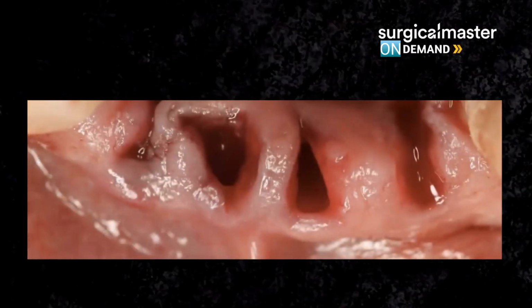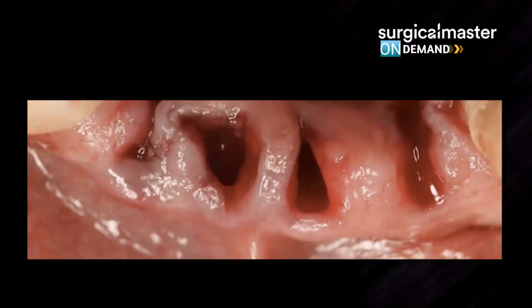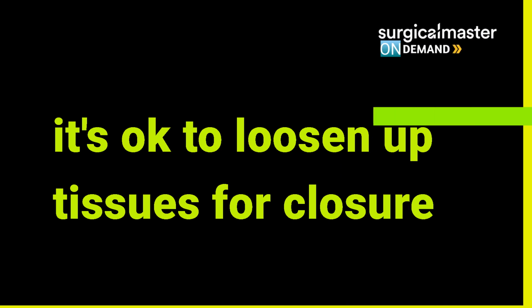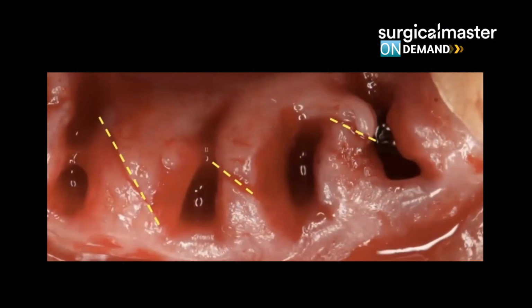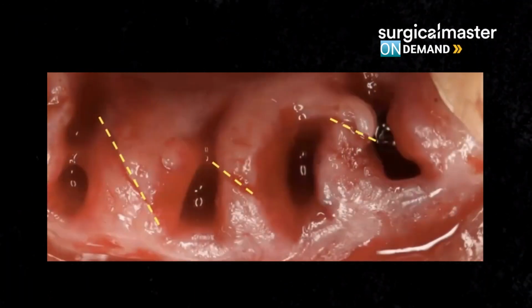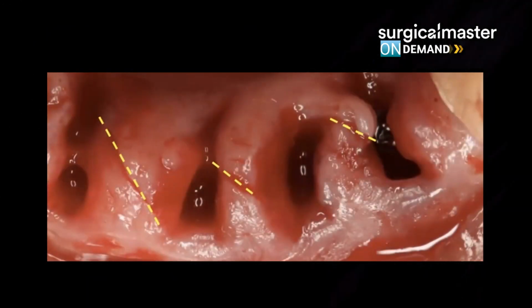So here is the flabby ridge right from the occlusal surface. You can almost see that this tissue is just moving all over the place. So I wanted to empower you to loosen up the tissues for closure. It's okay to make incisions. It's okay to release tissue every once in a while. And in this type of situation, I make a diagonal incision where the papilla used to be. Why am I doing this? Because then I can almost split the papilla in half.